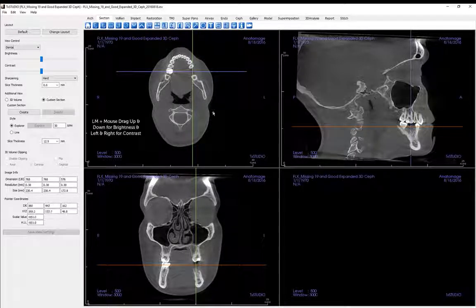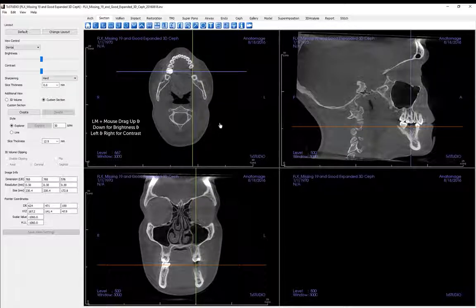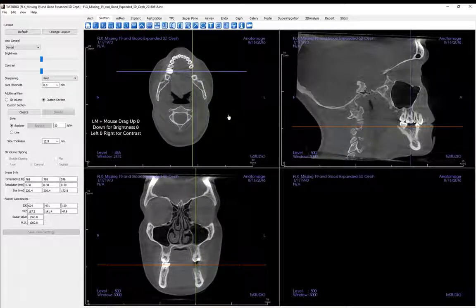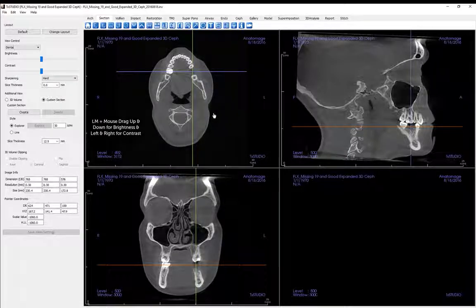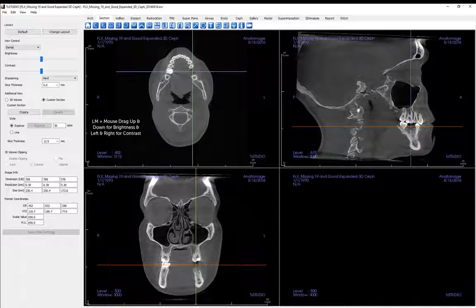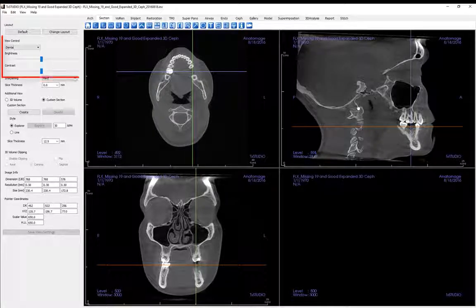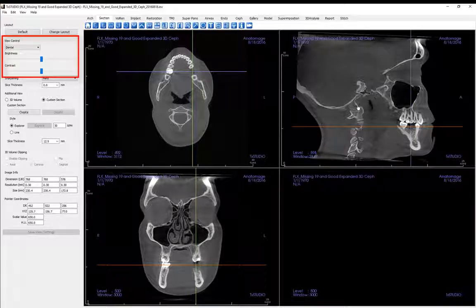To change the brightness and or contrast of the image, depress the left mouse button and move your mouse up or down for brightness and left to right for contrast. This can also be done by using the view control tools in the control panel.